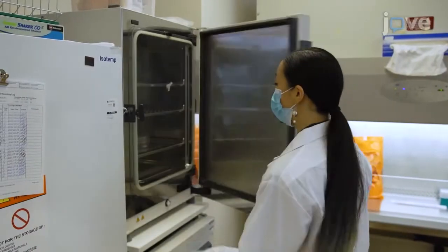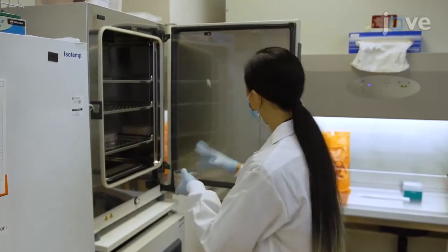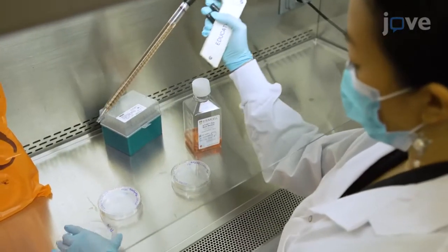Maintain human pluripotent cells at 37 degrees Celsius and 5% carbon dioxide in a 10-centimeter dish on laminin-521, feeding them daily with 10 milliliters of stem cell maintenance medium per dish.